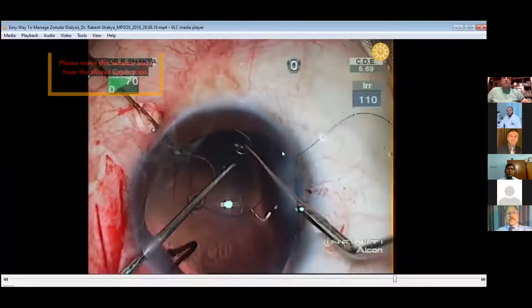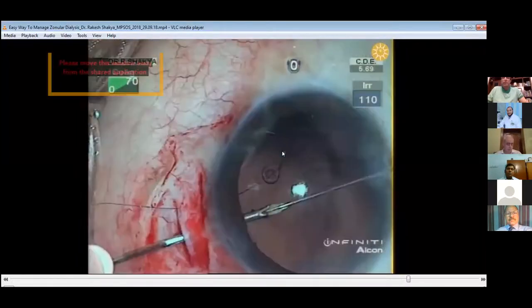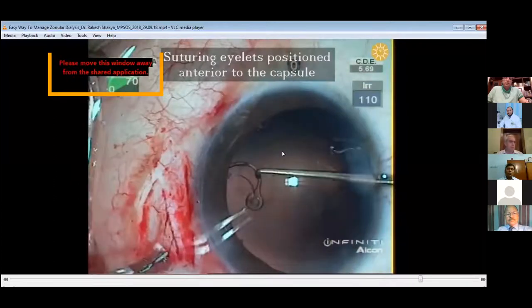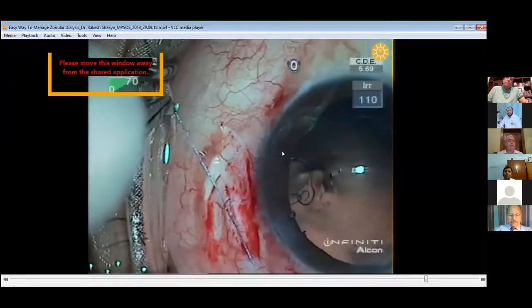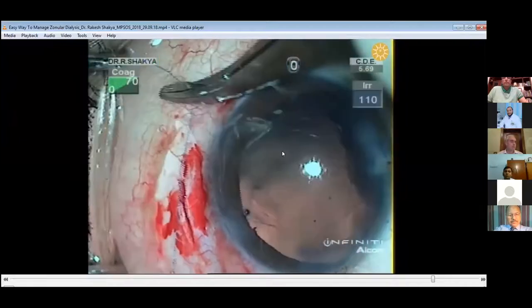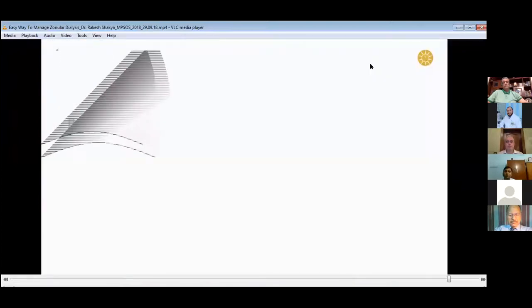About 2 mm away from the suture needle at the pupillary center, the needle with suture is brought out through the sclera. Similarly, another needle with suture is also brought out in the same way but placed 1 mm away from the first side. Ends of the rolling suture are now tied together and secure the ring with the sclera, with the capsular bag at center. Intraocular lens implantation was done. Surgery in the presence of zonular dialysis can be a challenging situation.